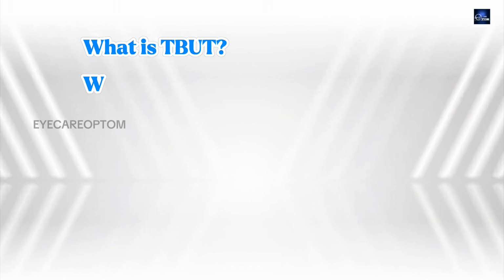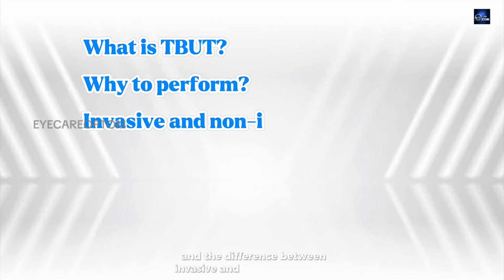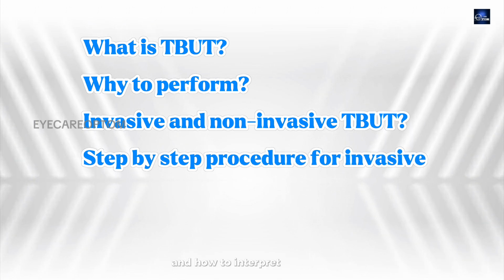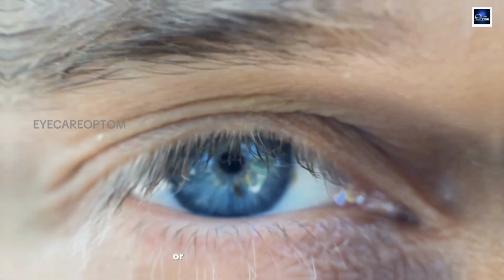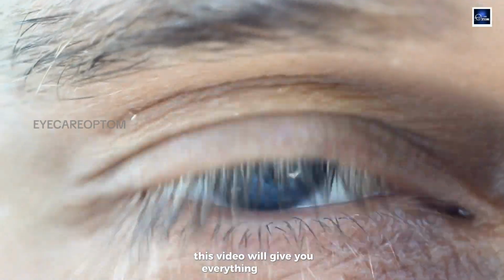In this video, we will cover what TBUT is and why we perform it, the difference between invasive and non-invasive TBUT, the step-by-step procedure for invasive TBUT, and how to interpret the results and the clinical significance of the findings. Whether you are an optometry student learning this for the first time or a clinician looking to refresh your technique, this video will give you everything you need.